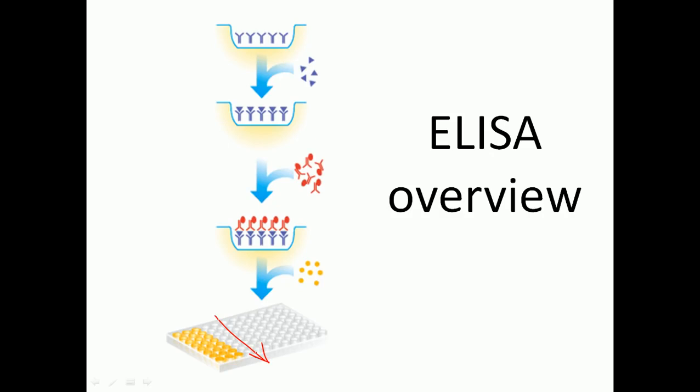But the thing is, we are diluting the sample, whether it's an antigen sample or antibody sample. Generally, it's a patient blood serum sample. It is continuously diluted. So as we dilute this sample throughout the wells, we can detect the amount of antigen or antibody present in each different well. That's why we can understand it quantitatively, and we can also tell the exact concentration at the picogram level. We can construct a graph with these values, and that's why ELISA is very important, guys.